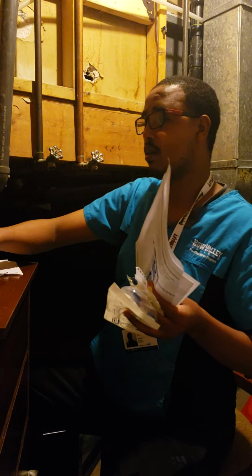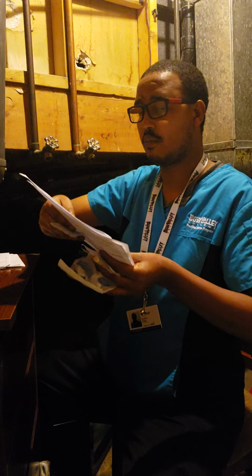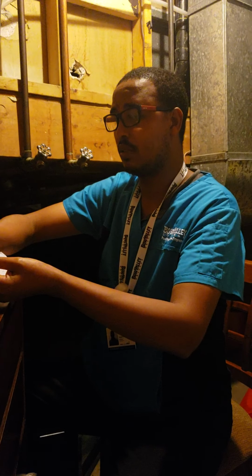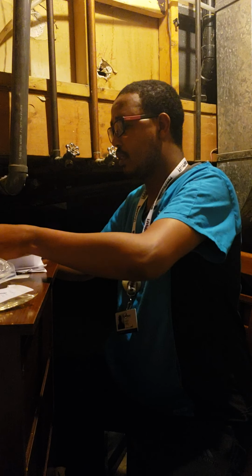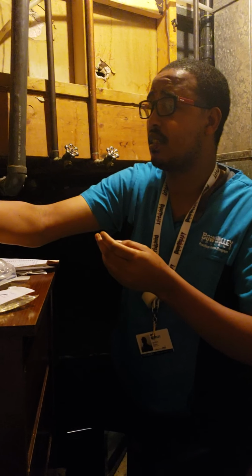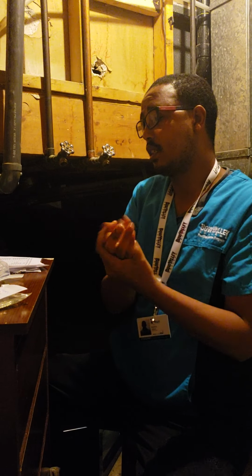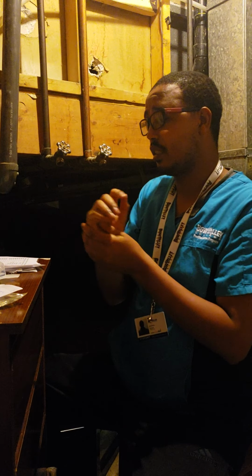Knock knock. Hello, my name is Ibrahim Adam. I am a practical nurse learner at Bow Valley College, and today I am here to hang your medication. So can you please spell your first and last name? I have to do hand sanitize. Can you please spell first and last name? He said Chinook Alison, date of birth 1960 December 11.